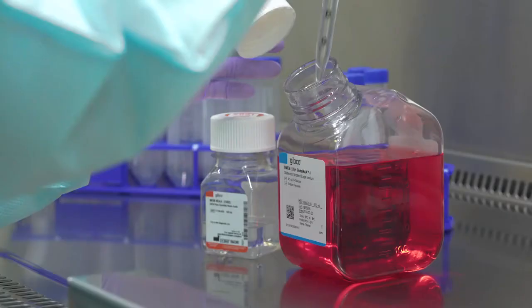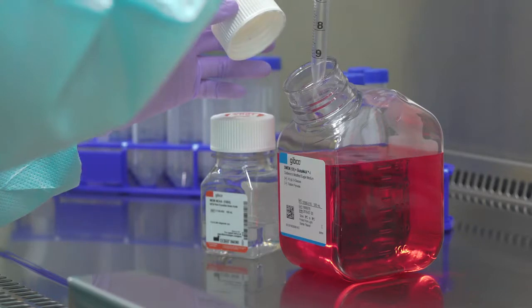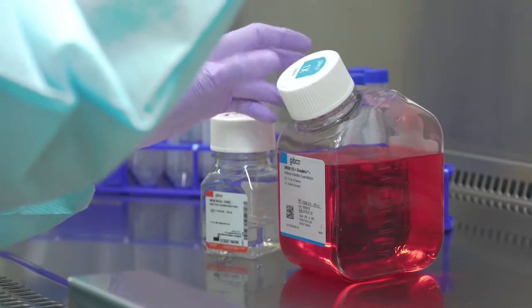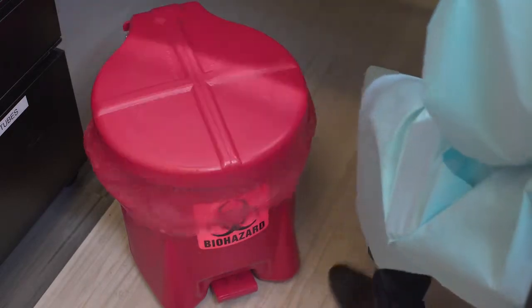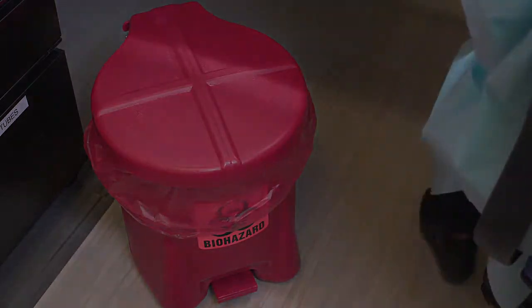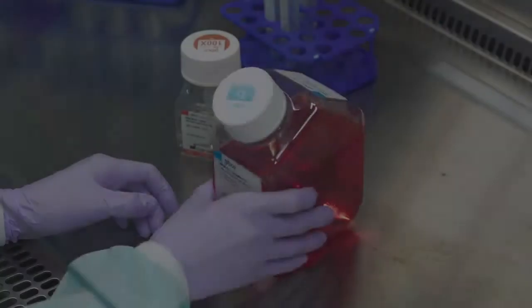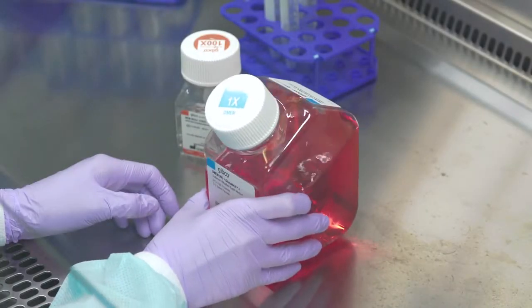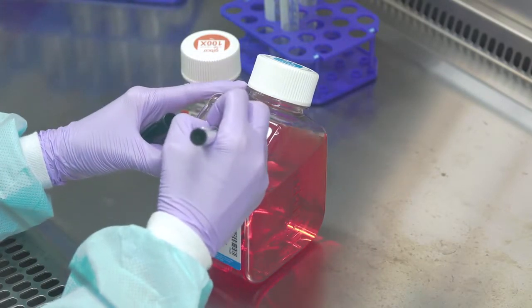When pipetting, try not to touch the pipette to anything non-sterile, particularly the outside of containers, or contamination could result. Each pipette should be used one time and discarded, or washed if using glass pipettes. Reusing pipettes by dipping directly into another media bottle or by leaving it standing in a media bottle increases your chances of spreading contamination. Gently mix the contents after supplementation, and labeling the bottle after supplementation is a good laboratory practice.